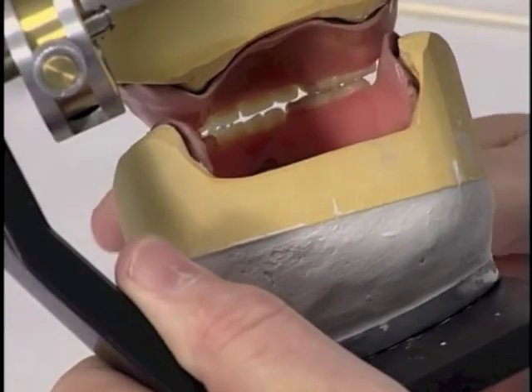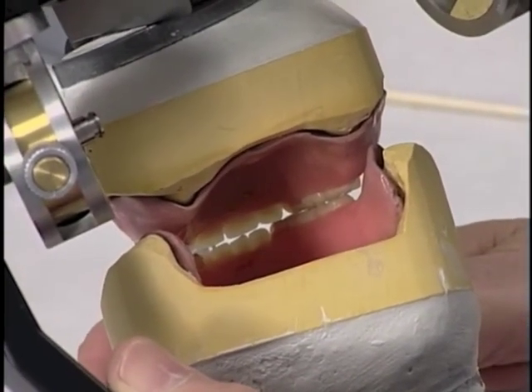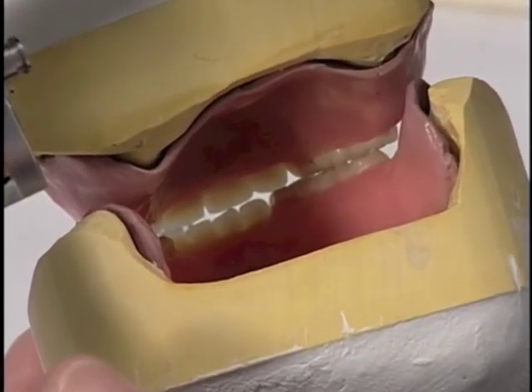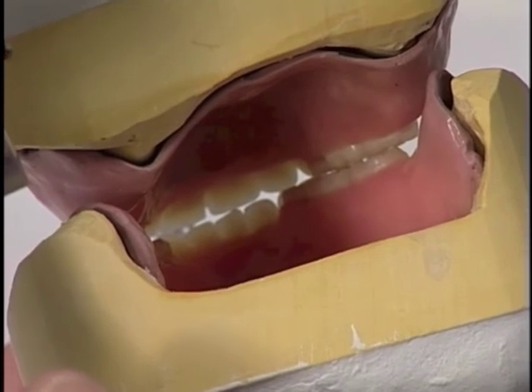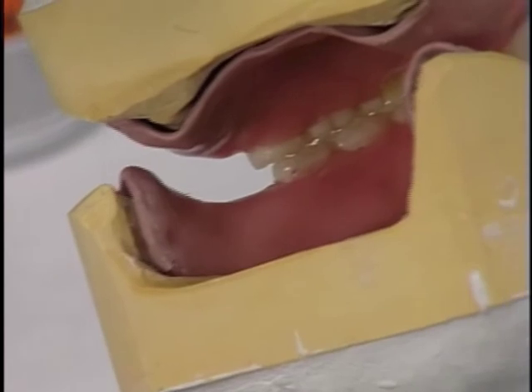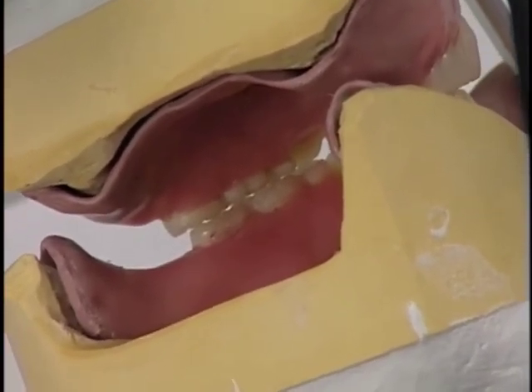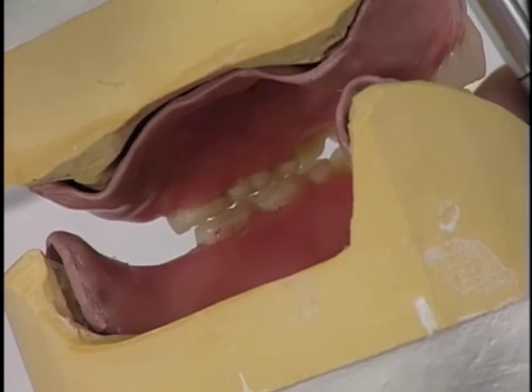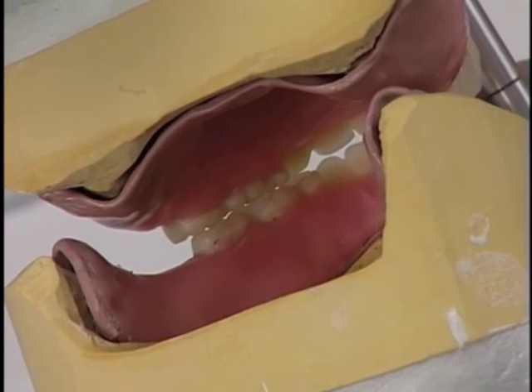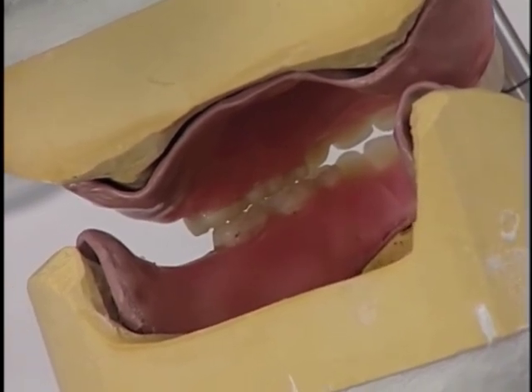And when we look at the linguals, we need to observe that we have maximum contact of both the buccal and lingual cusps of the teeth on each side on the 3 posteriors that we've arranged in each quadrant. And when we look at the contacts between the maxillary and mandibular teeth, we have both lingual and buccal cusp contacts, and that we have the maximum amount of contact of the occlusal surfaces of the maxillary teeth with the mandibular teeth.